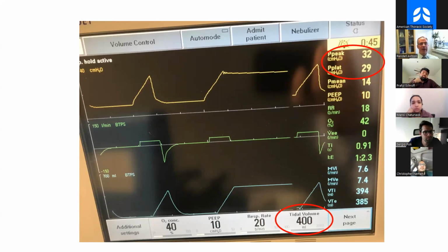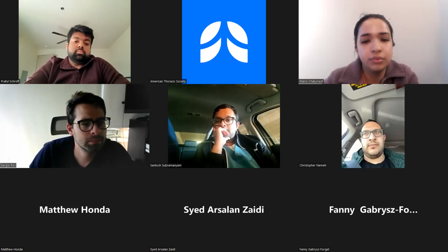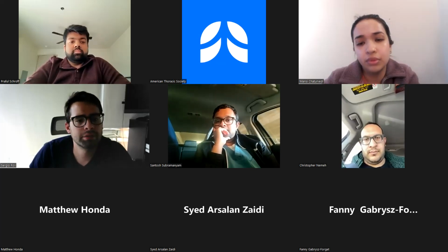Is that going to be okay? Well, he's already acidemic with a high CO2, so we're going to have to watch that pretty closely, right? What if he comes back too acidemic? What if he comes back 7.12? Then what do we have to do? And increase the rate.